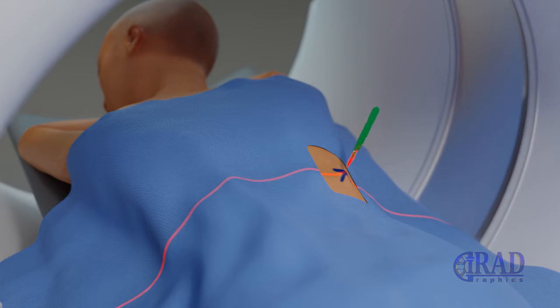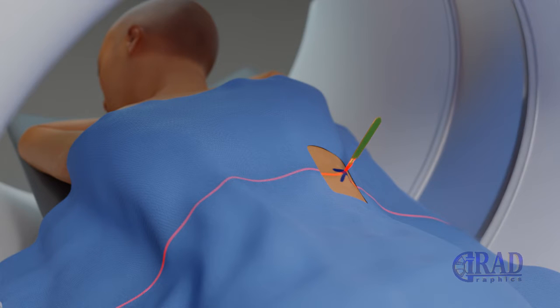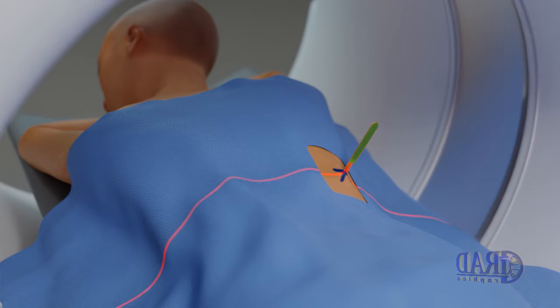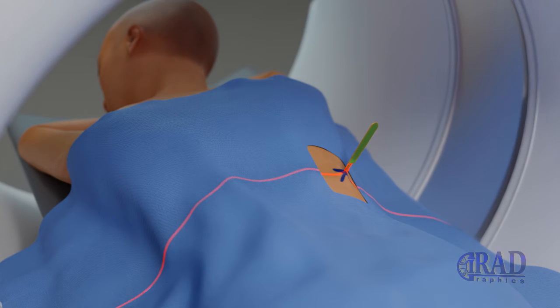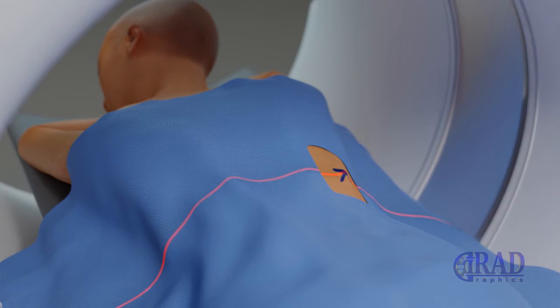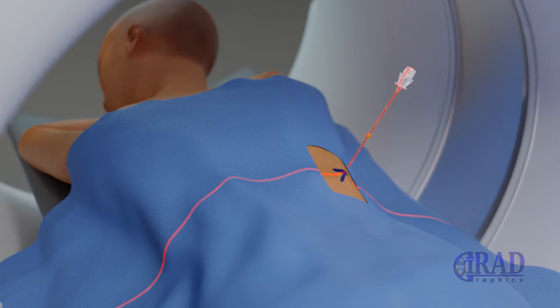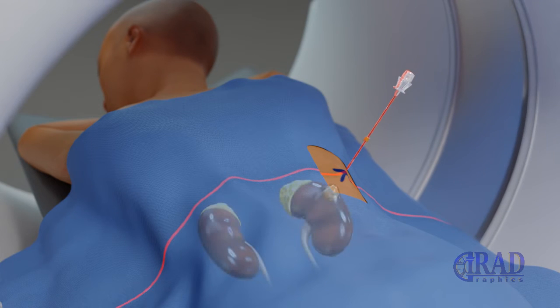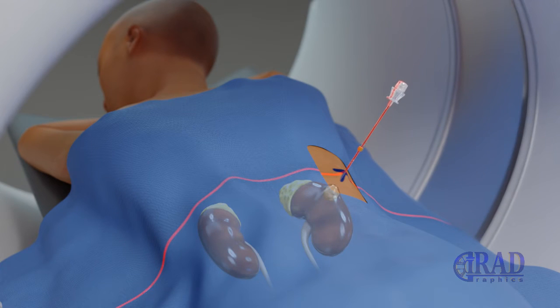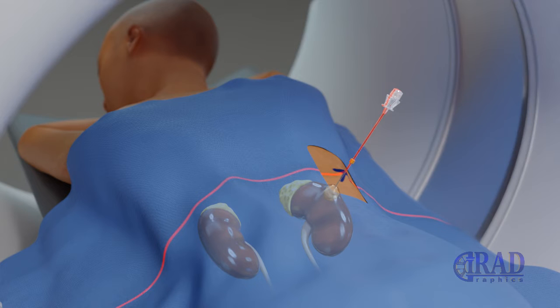A very small nick may be made in the skin to make it easier to pass the needle into the renal lesion. Then the tip of a cannula is placed within the renal lesion under CT guidance.